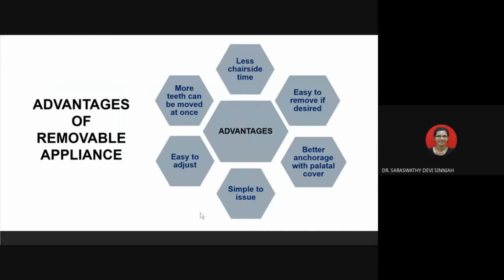Removable appliance is a simple appliance. It is easy to fit and adjust. It can be prescribed by most clinicians, and it does not require extreme specialized knowledge. By using a removable appliance, all components are connected by a base plate. It is more efficient to move blocks of teeth as compared to fixed appliances, as it is able to transmit forces to blocks of teeth faster.